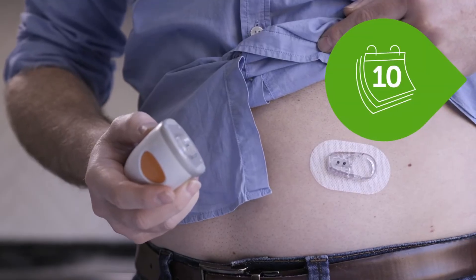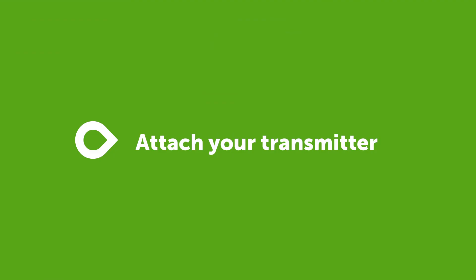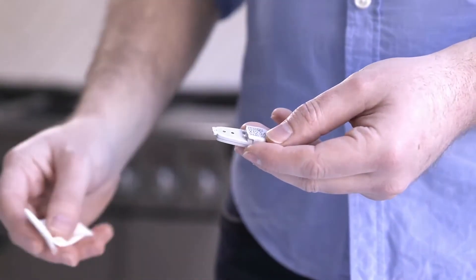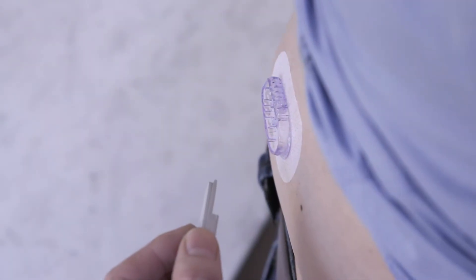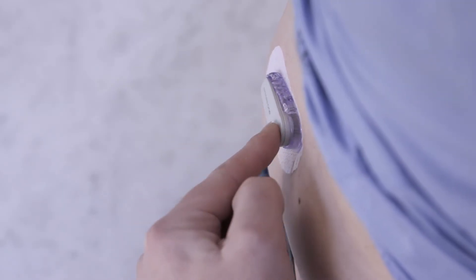Your sensor will last for up to 10 days. Now it's time to attach your transmitter. Clean your transmitter with an alcohol wipe and let it dry. Insert the transmitter tab first into the holder.